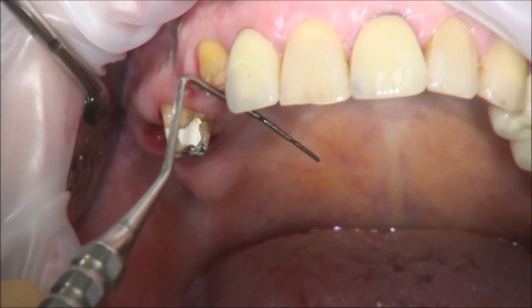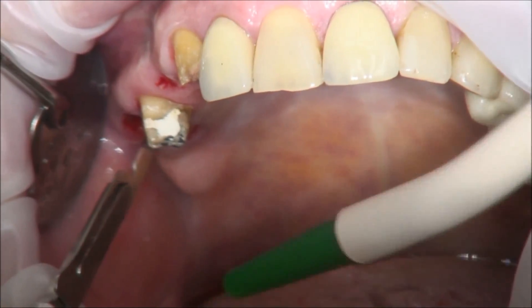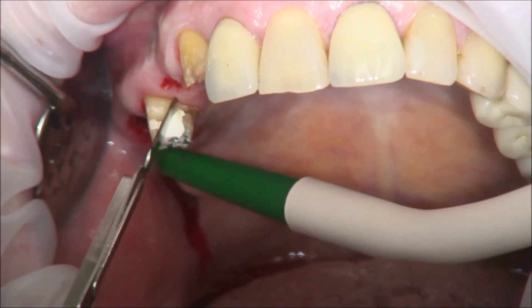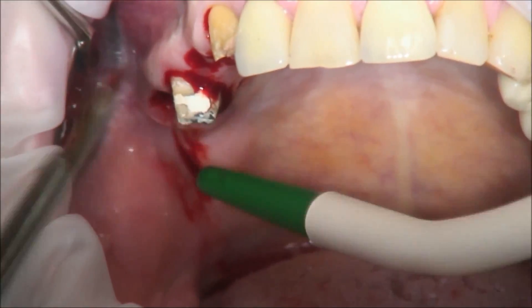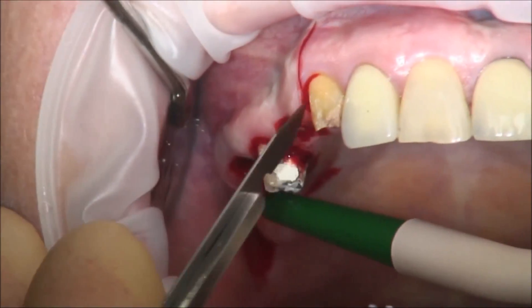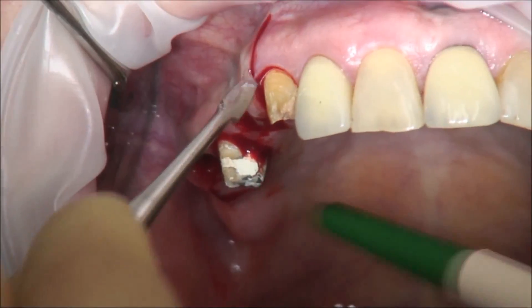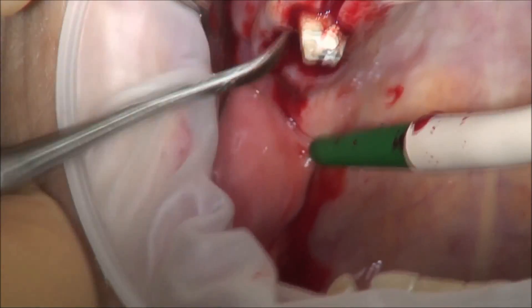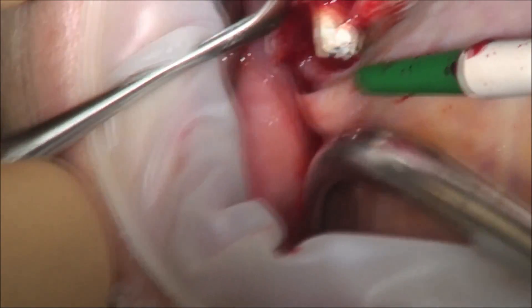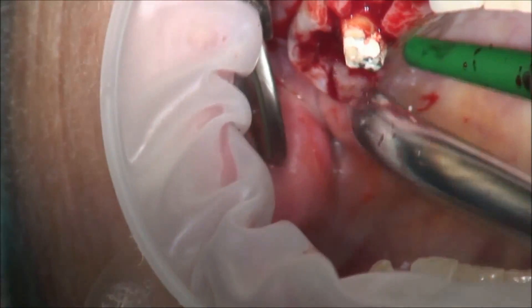This is the beginning of the surgery. We clean the area and measure the width of the bone — we know exactly where the implants are planned. Extraction of the first molar and second premolar. The incision line goes to the palate, with two release incisions — one mesially and a small one distally. We also made a release incision distally from the canine. We elevate the flap with a small elevator, then use a second elevator to elevate the buccal area and create a good view for the surgical procedure.